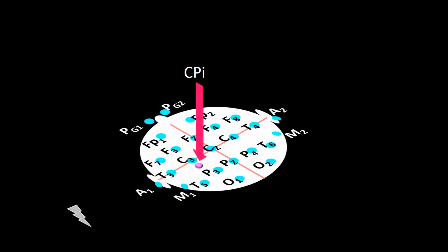So, since at the beginning of a study the location of P37 is unknown, some authors recommend that different locations be surveyed prior to selecting the site for the placement of the cortical electrodes.